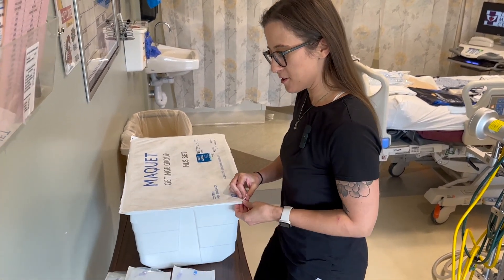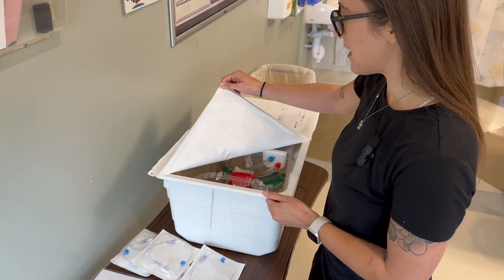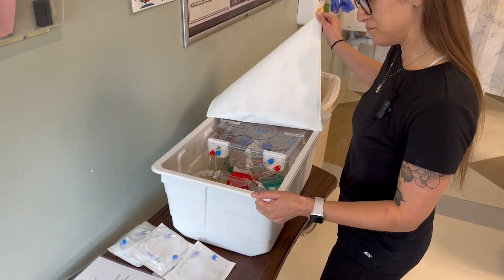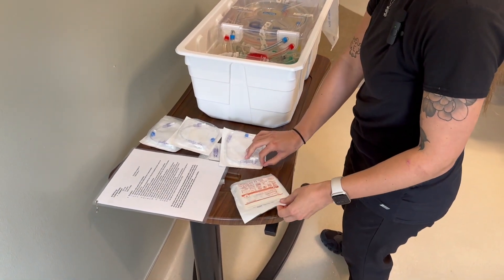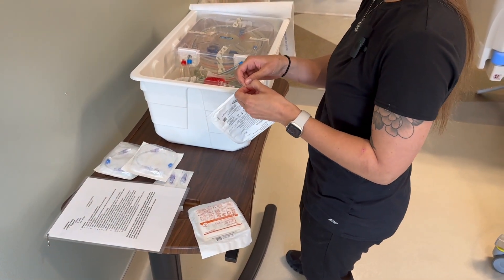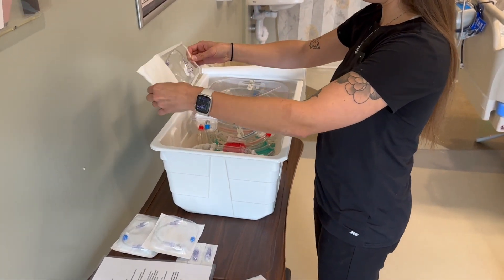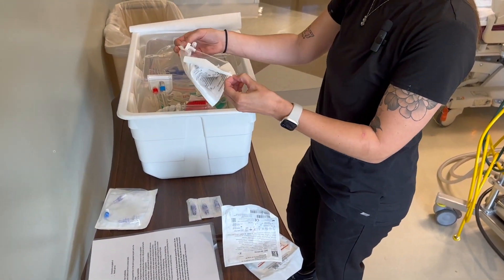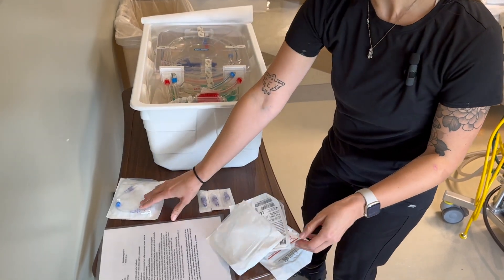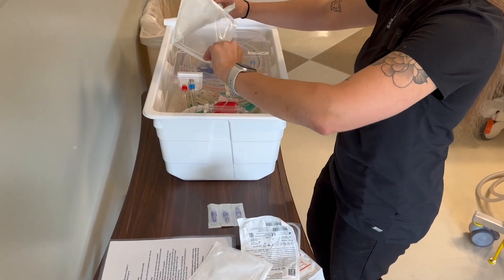Today we're going to set up a dry circuit for ECMO. First, you're going to open the HLS set in a sterile fashion and leave all the contents inside. You're going to don sterile gloves after you put the pigtails inside the box. Try to be as sterile as possible. You need three pigtails and you also need three sterile claves.